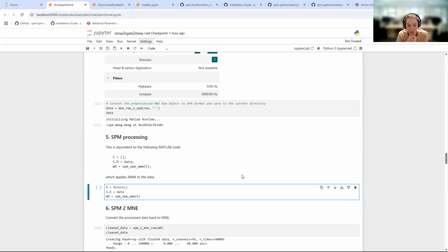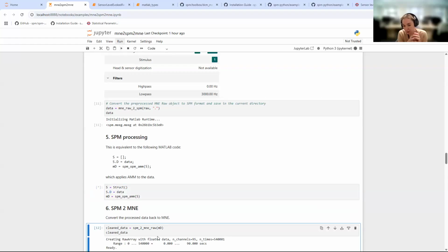The other way around is important, because MATLAB has these TRA matrices that would save you, for example, in the OPM case, if you do some kind of pre-processing on the data, like a filter later, it will save this transformation, what you did to the data, so you can then apply it to the forward model.